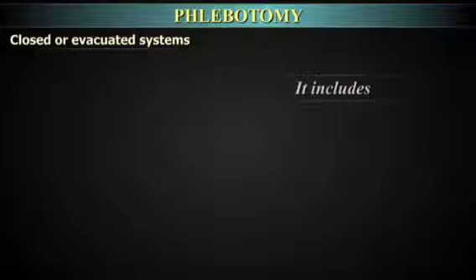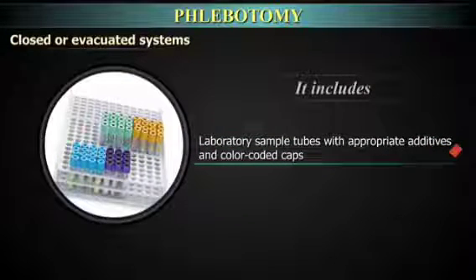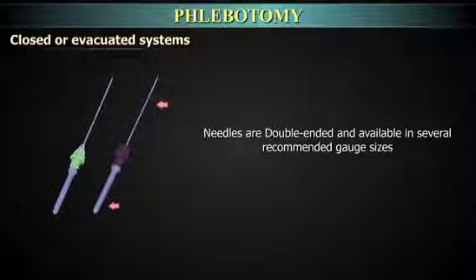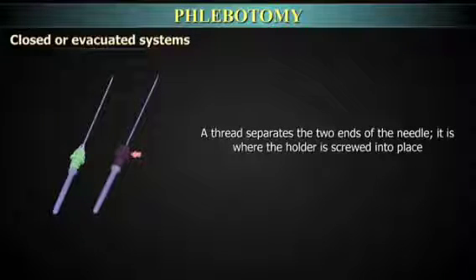The system comes complete with needle, holder, and the laboratory sample tubes with appropriate additives and color-coded caps. Needles are double-ended and available in several recommended gauge sizes indicated by color codes. The non-patient end of the needle is covered by rubber sleeves and is screwed into the barrel, also known as the tube holder. A thread separates the two ends of the needle. It is where the holder is screwed into place.